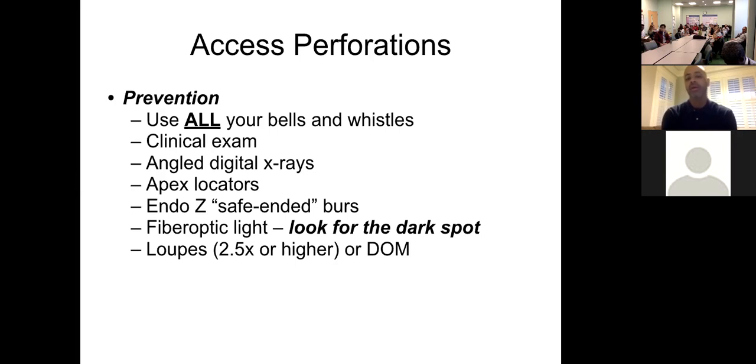Whenever you're using apex locators, they are very helpful in detecting perforations. If you put your file in and hook your apex locator up, and the apex locator just starts beeping up and down, going kind of crazy like this, most likely you perforated the tooth. That's a little tidbit for you to remember.